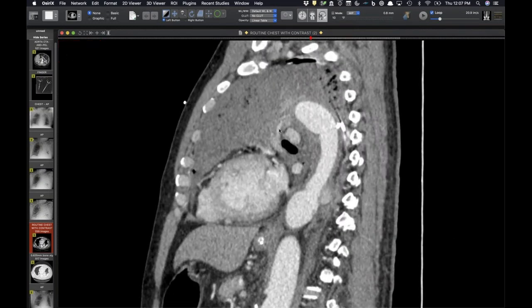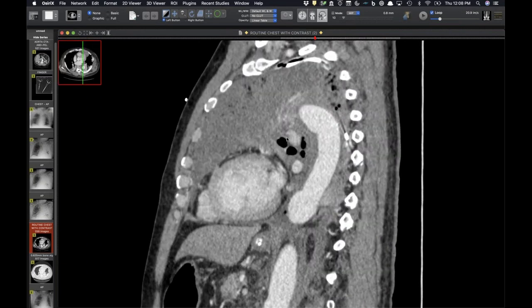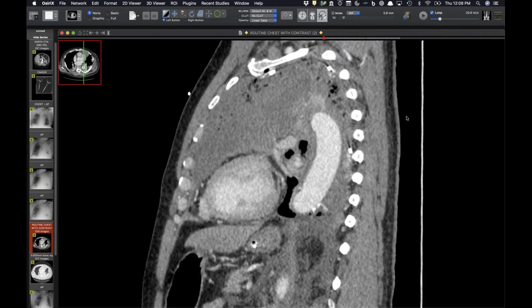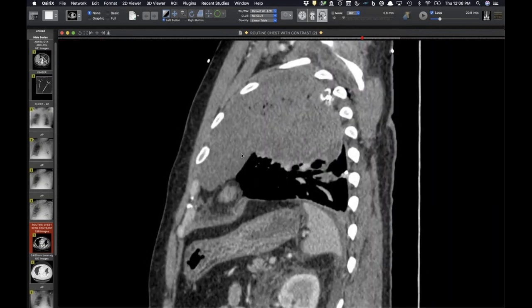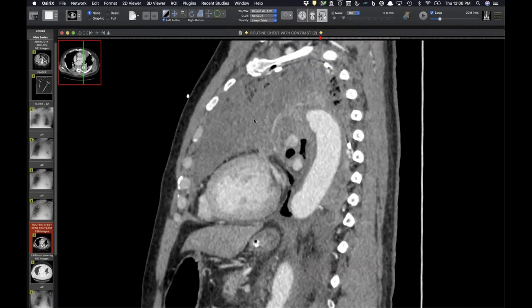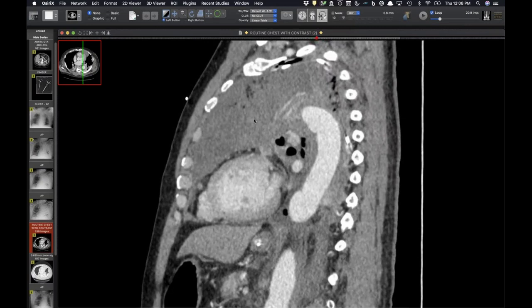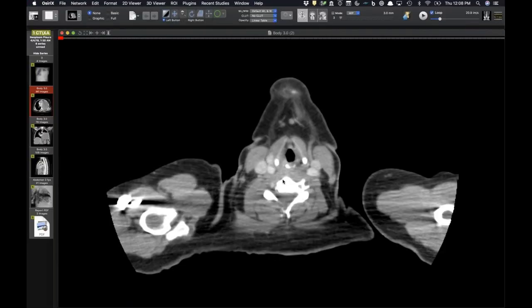What's the direction of the 180 here? So can you explain to me? I think that based on how things are curving, I'm guessing that it rotated. They said clockwise, and I guess that means from a left-sided approach, it means from front to back, I guess. But this is all lung, because I think they were doing that CT wondering if there was going to be a big hemothorax or whatever, but this is all just dead, infarcted lung at this point in time. Wow. Gee. I know, the torsions have been coming frequently recently.